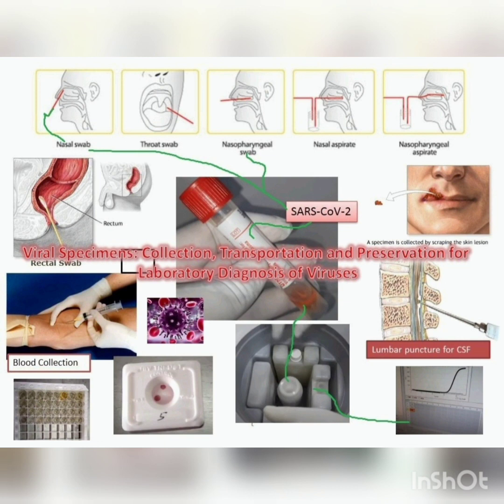To do that investigation, there is a laboratory in BIMS Medical College. So they collect the specimen, store it in a particular container, and send all the samples together at once to BIMS. This is the procedure we are going to discuss.